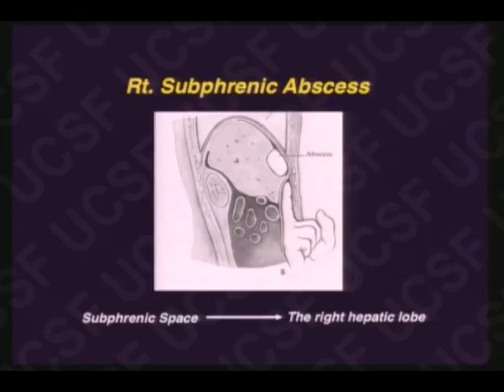Now, what's my point? My point isn't to make fun. My point is the surgeon's trying to drain an abscess. He doesn't really give a damn about the transversalis fascia and the cupola of the hemidiaphragm. He's interested in the abscess. Same thing with an interventional radiologist. Same thing with you looking at a CT scan. You're not really interested in all that other stuff. You're interested in finding the abscess.